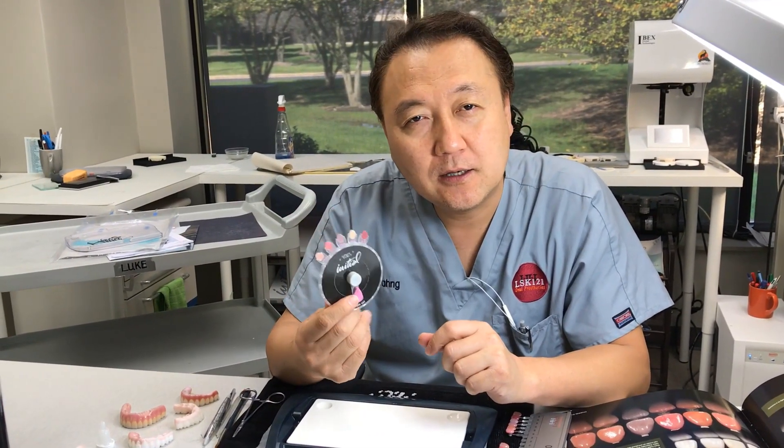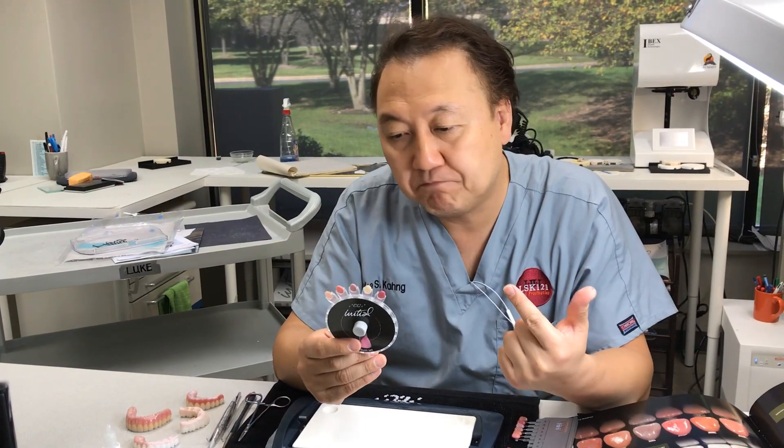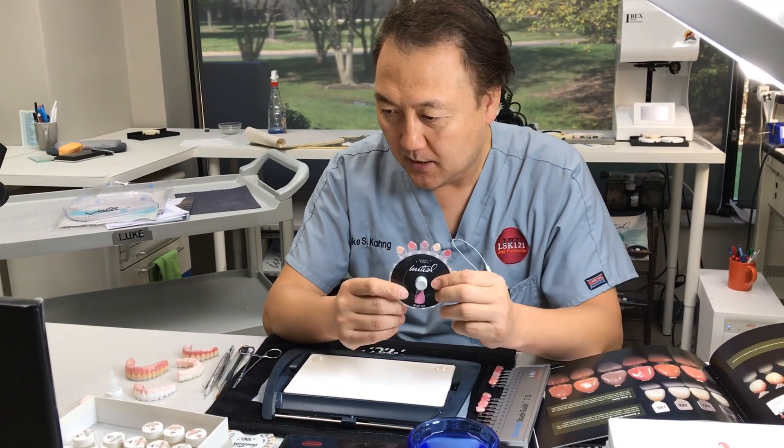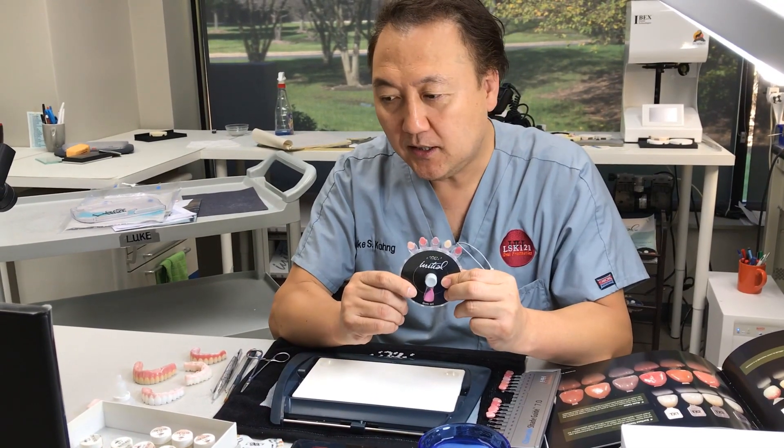Not only Pink Porcelain and Zirconia, but also Titanium, Metal Ceramic, and LISI Press. So this is a good key.